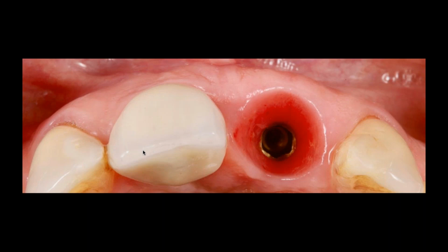Can I use a PMMA block for these? Sure, you can, and then you can move to a final ceramic restoration. But I think that having this possibility of the implant solution blocks that don't need any sintering or crystallizing, you can have them ready very fast, and they will last much longer than a PMMA. So I think it's a nice option to have them around.